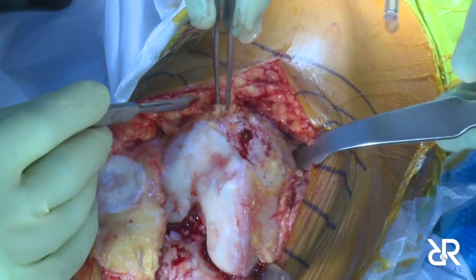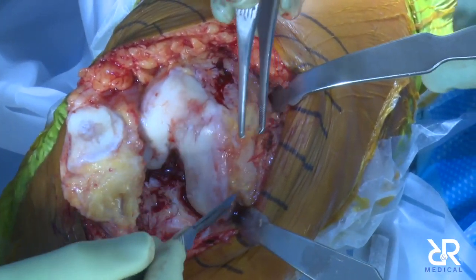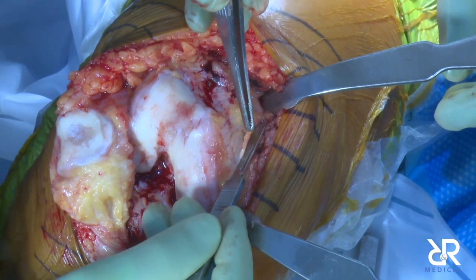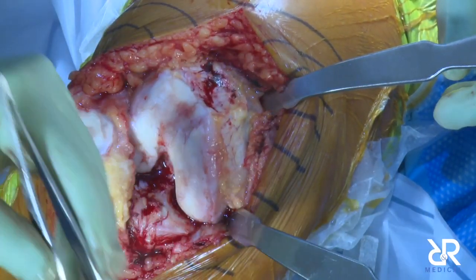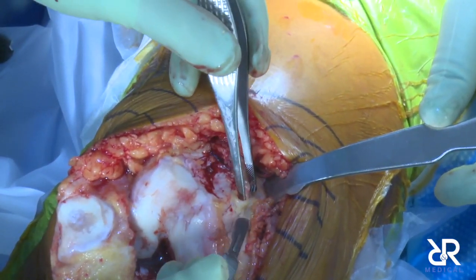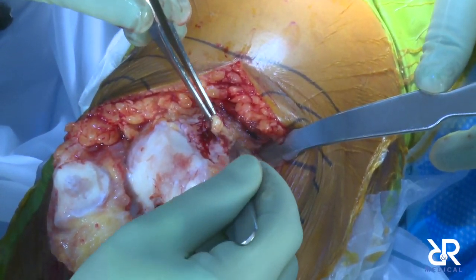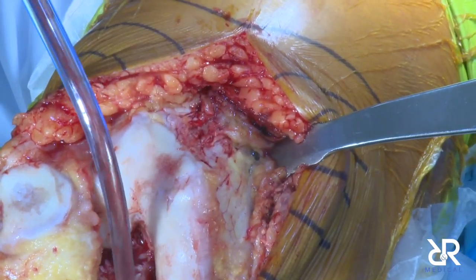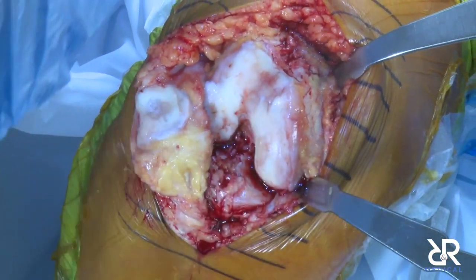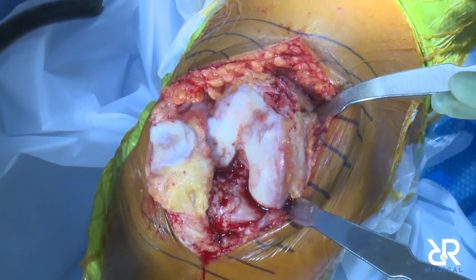Yeah, so there's really not a deselection process. In the surgery center, we do have some challenges with cost, right? Because Medicare reimbursement is fairly low. But I think any knee replacement is a great candidate for robotic-assisted surgery, especially the ones with a little bit more deformity. Especially with a new platform, I think it'll be really good to fine-tune the surgical plan, because we can then fine-tune the distal femoral cut as well as the proximal tibial cut.